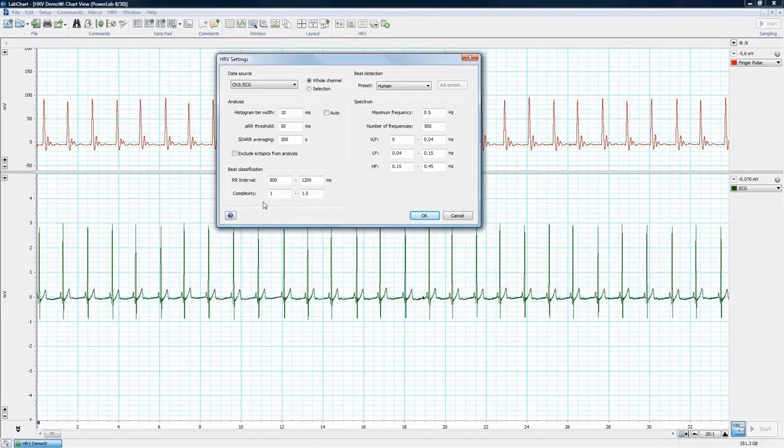So typically ectopic beats that just don't quite follow along with a normal-looking ECG like what we're seeing here will have a high degree of complexity. The proper values to use here depend. These are the defaults, of course, but if you want to change it to something that works better for your analysis, by all means go ahead. And these actually come into play later on with the new beat classifier view, which is very similar to some of our other classifier views for things like ECG analysis.